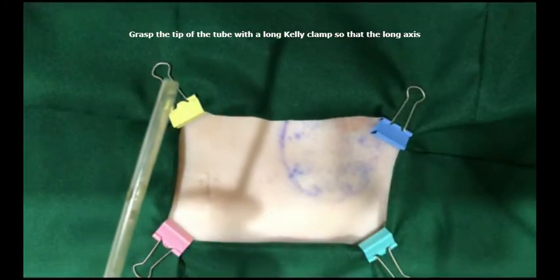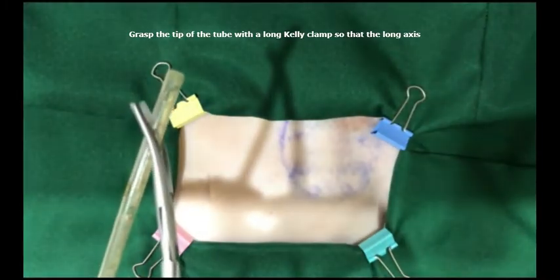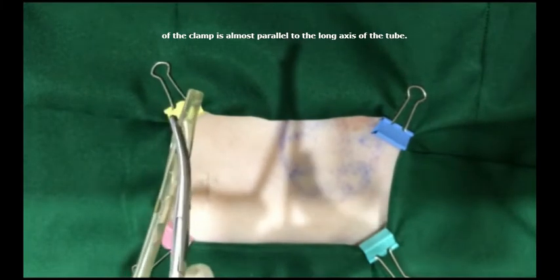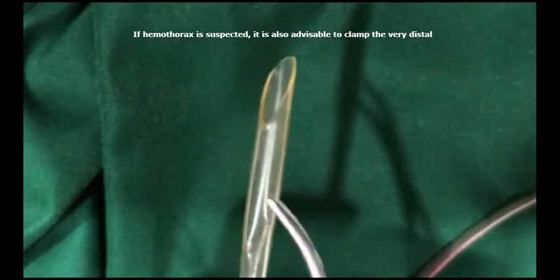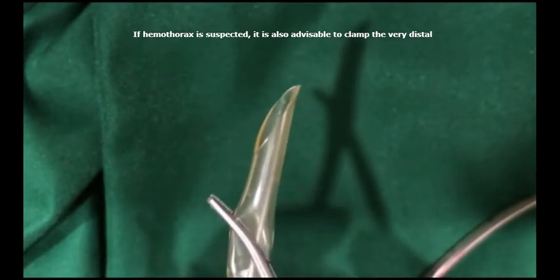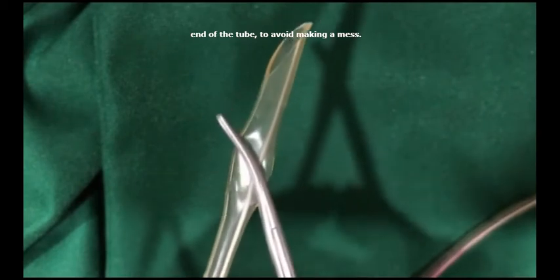Grasp the tip of the tube with a long Kelly clamp so that the long axis of the clamp is almost parallel to the long axis of the tube. If hemothorax is suspected, it is also advisable to clamp the very distal end of the tube to avoid making a mess.